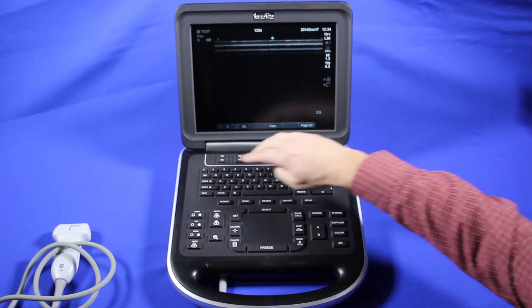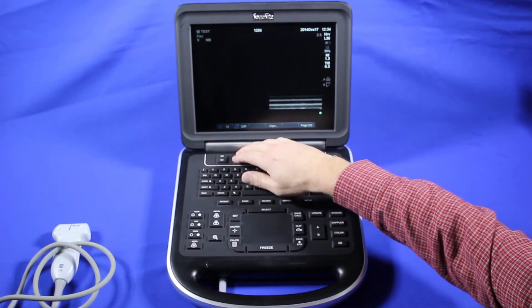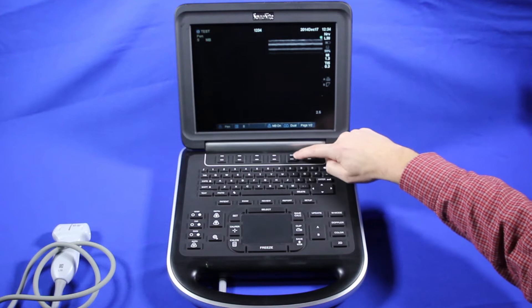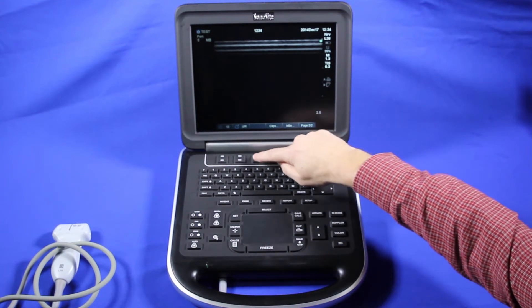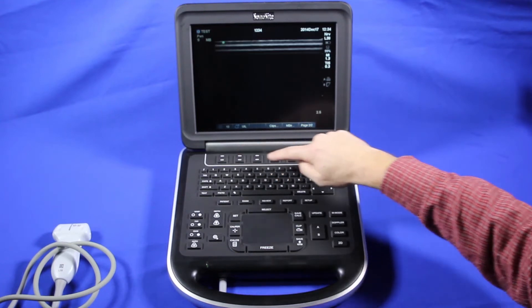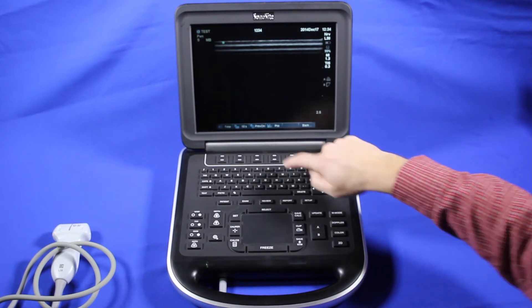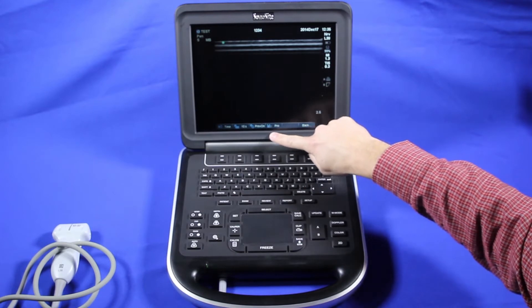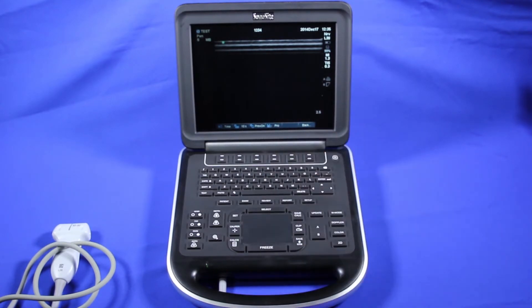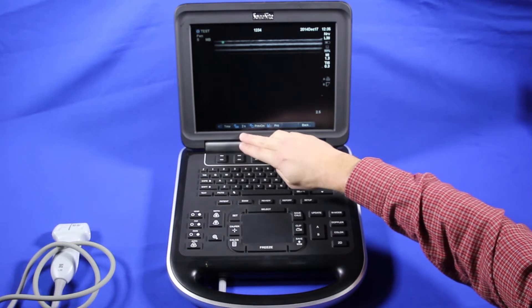Go to page 2. This is your screen brightness — you can turn up the screen brightness here. Your orientation — we'll go left, right. Clips can be stored based on time or heartbeats, and you can have a preview on. You can choose pro or retro for storing your clips. If you choose how many seconds you want to store a clip, let's say we're going to do two seconds.